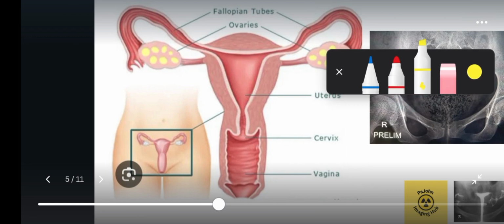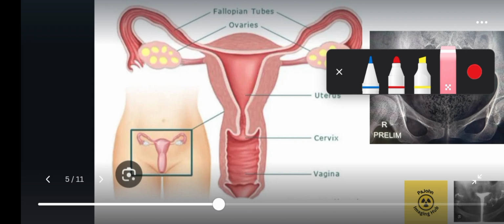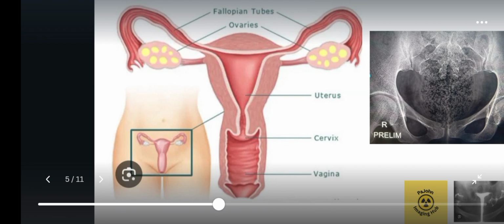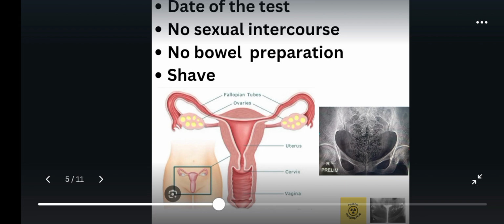What is going to flow is the surface of the inside of the womb. These surfaces will flow out. That time it becomes engorged, just sticking like this. So we don't want to introduce contrast or media into such a situation. We're going to have a lot of resistance. So HSG is done in such a way that we avoid these two periods in the patient cycle.